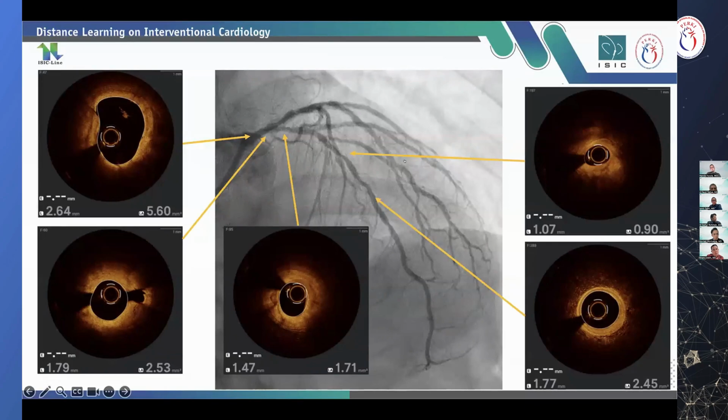Yeah, approximately, this is the more in detail. The size of the left main was about 5 millimeters. The ostial and the proximal LAD was around 3.6 to 3.7. Maybe we can downsize the stent about 3.5, while the mid LAD was around 2.7 here. So yeah, this is the very tight lumen in the mid of the LAD here, just after distal to the diagonal too.